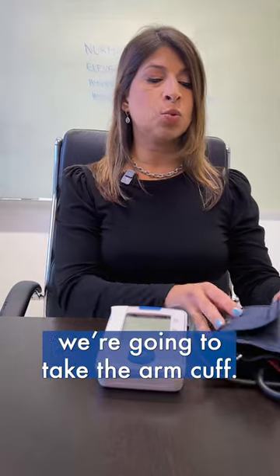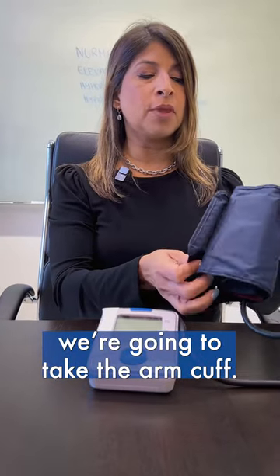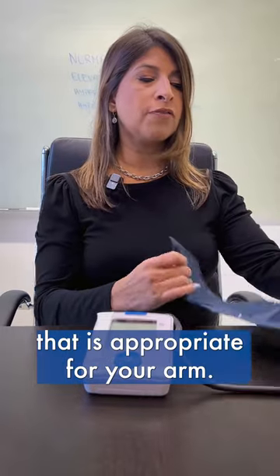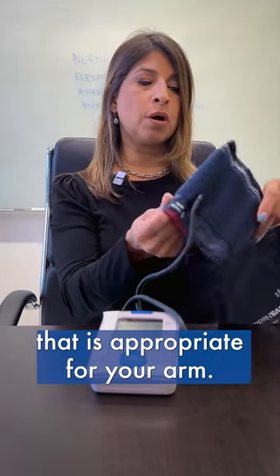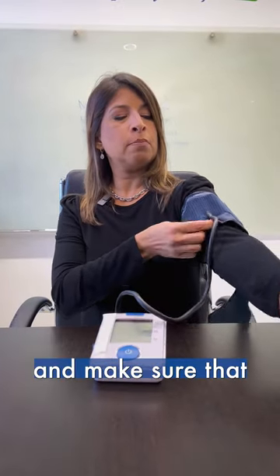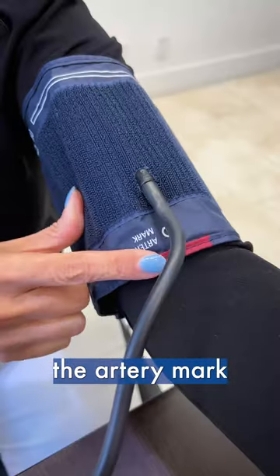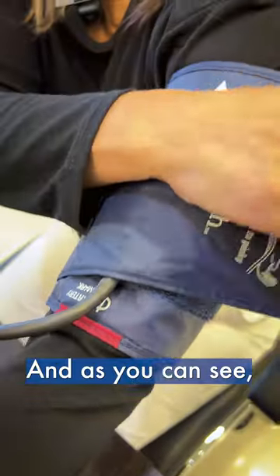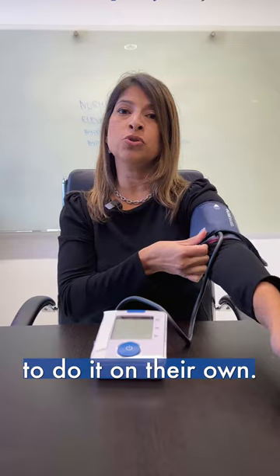Now that we've been sitting for five minutes, we're going to take the arm cuff. Make sure that you get an arm cuff that is appropriate for your arm. Put it up your arm and make sure that the artery mark is in the front of your arm. Tighten it — as you can see, it's very easy for one person to do on their own.